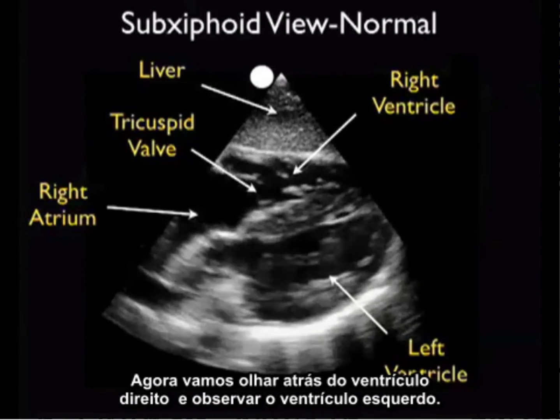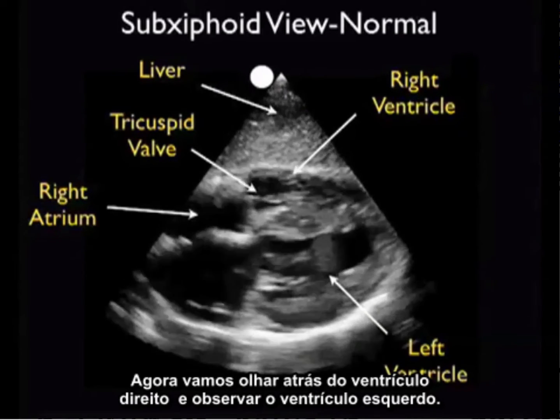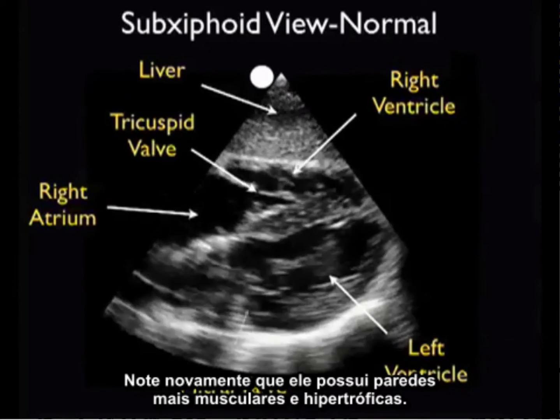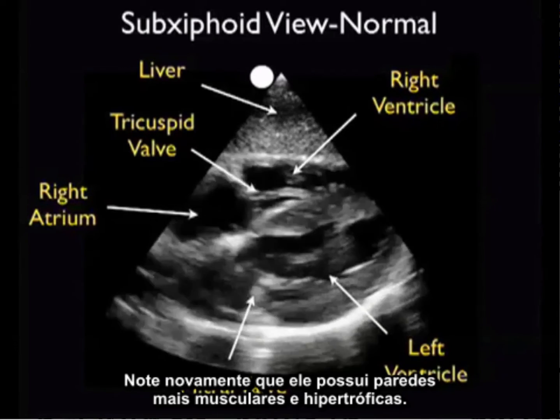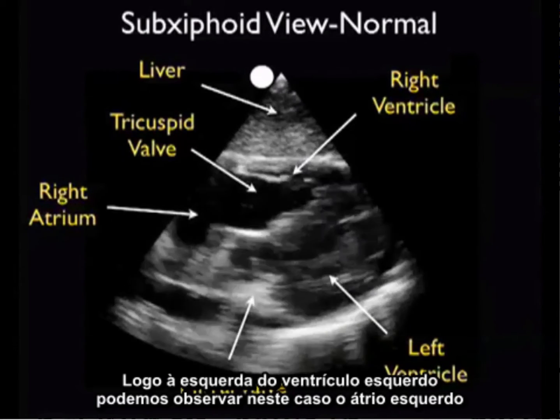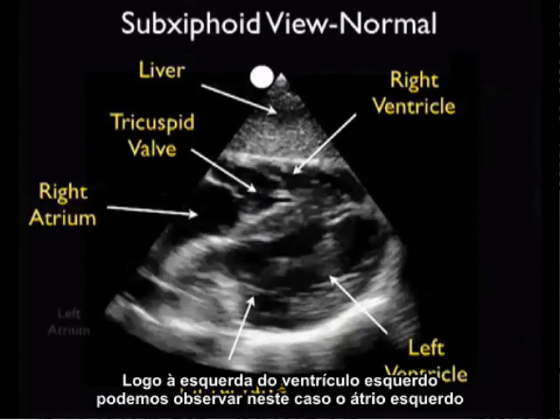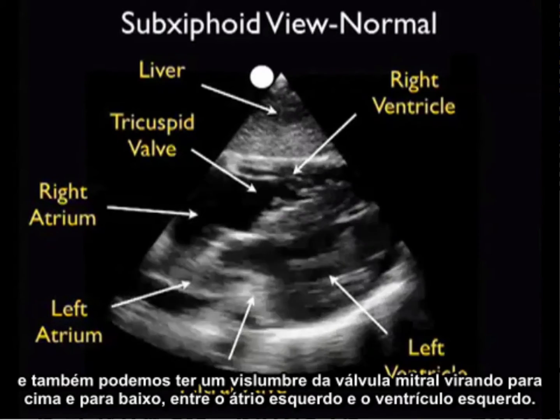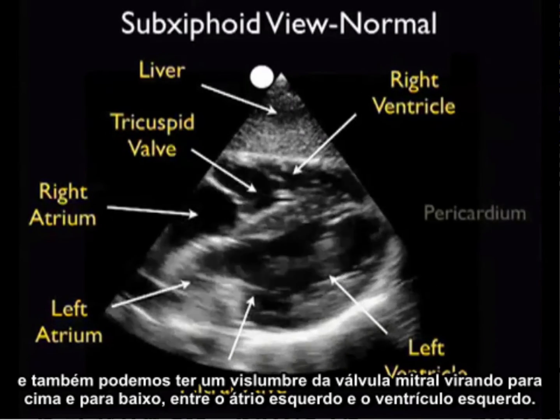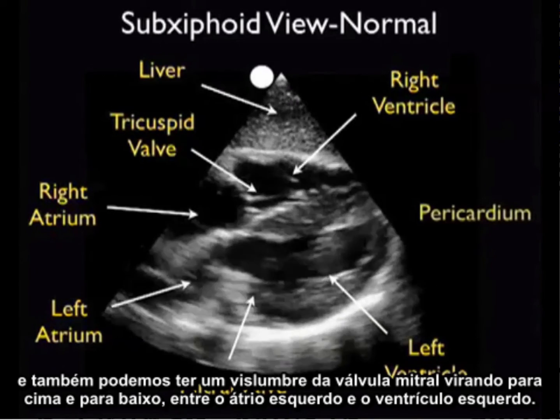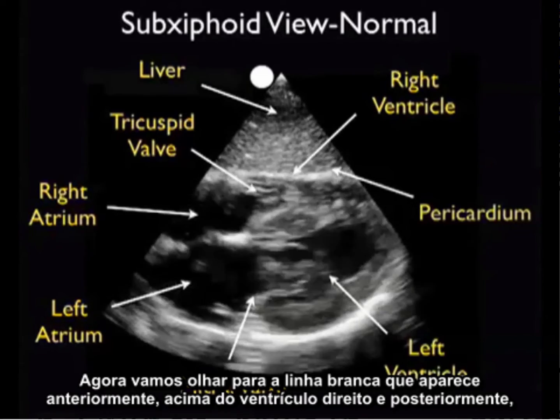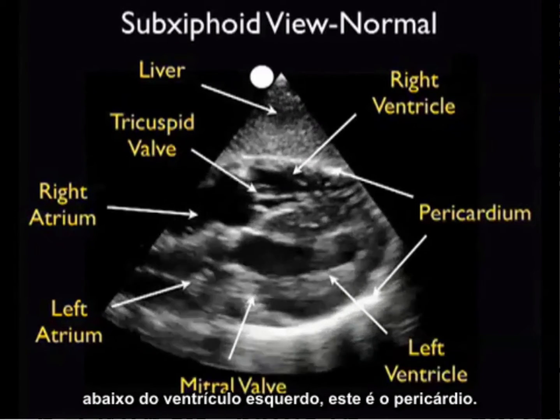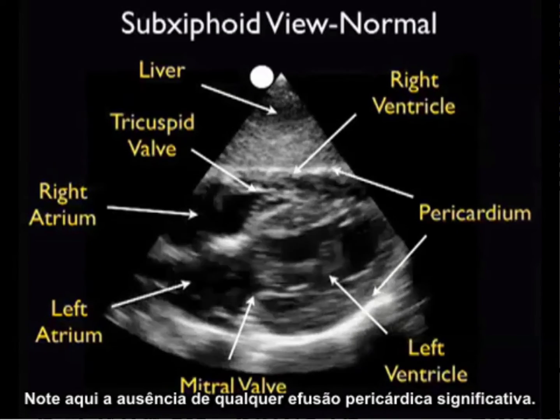Now let's look posterior to the right ventricle where we appreciate the left ventricle — notice again its more muscular and hypertrophic walls. Just to the left of the left ventricle, we appreciate the left atrium, and we also get a glimpse of the mitral valve flipping up and down in between the left atrium and the left ventricle. Now let's look at that white line both anteriorly above the right ventricle and posteriorly below the left ventricle — that is the pericardium.